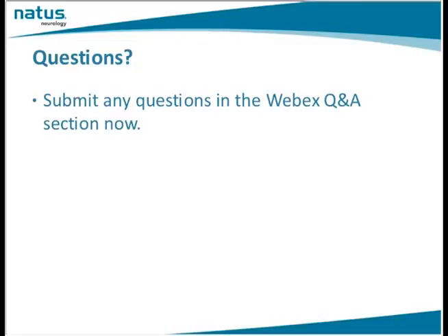You know, Katie, there's nothing we can do about that. I mean, with the Bovie, it's going to obliterate your screen. Yeah. There's nothing you can do.